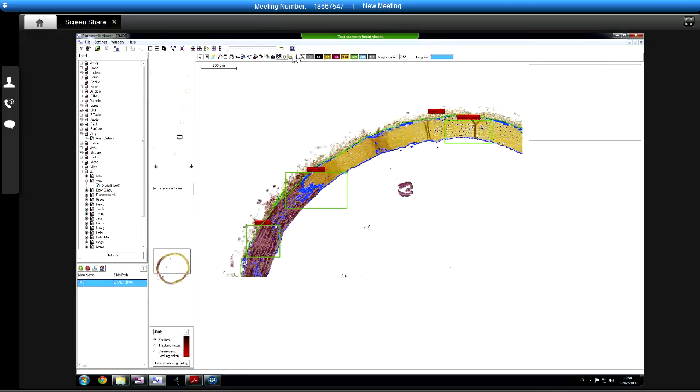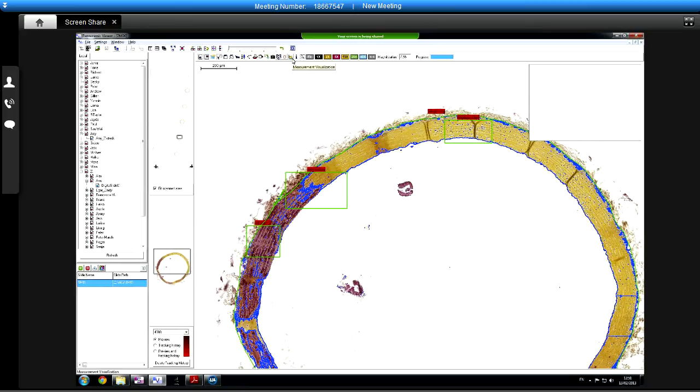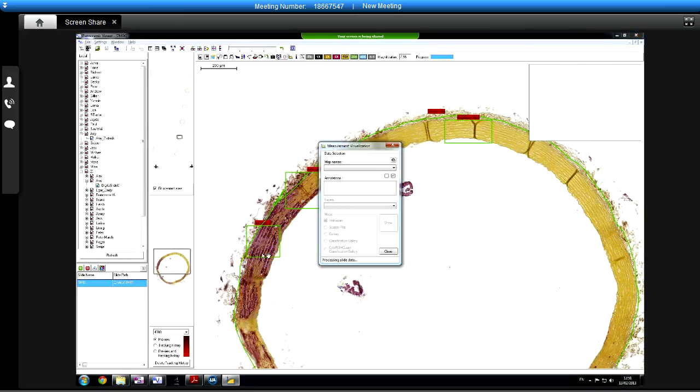And you've got the Excel files that come out, which are your raw data, and you've also got the measurement visualization, the little graph button, which allows you to go in and either look at the gallery to review what's been found, showing you all the objects in one place, or the histograms and the scatter plots where you can re-gate the data to say I'm only interested in certain sizes or whatever, either to help you set it up or to regenerate the data file with a subset of the data in.